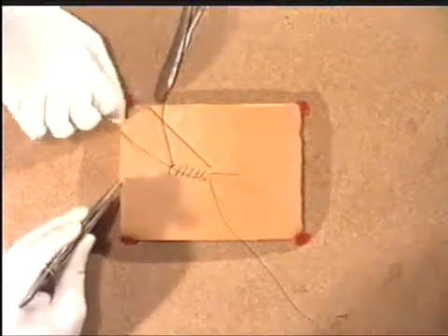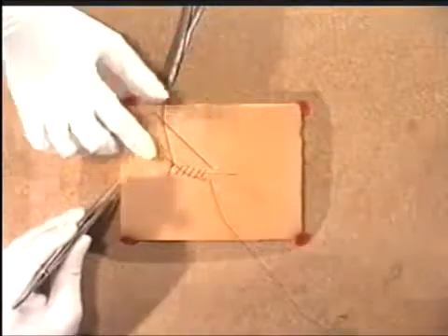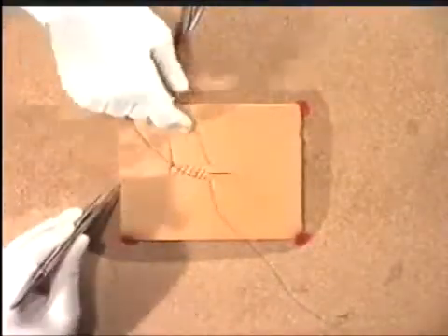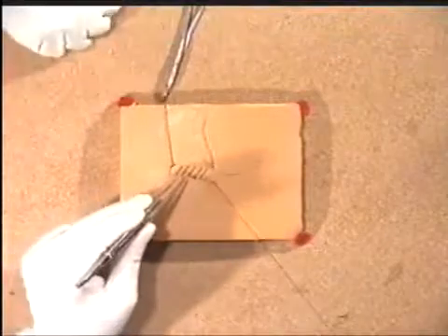The assistant then starts to put their hand into the middle of the surgeon's view, which is even worse, but eventually the suture material is freed.